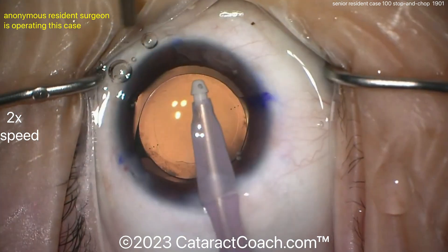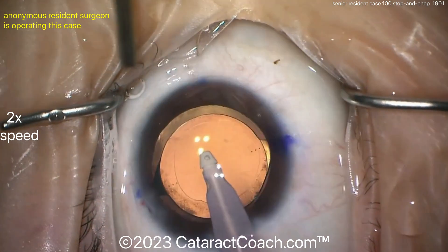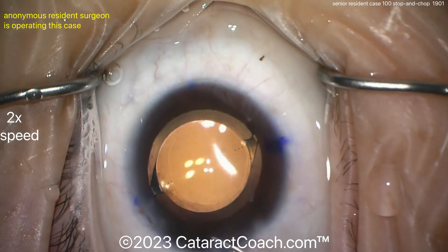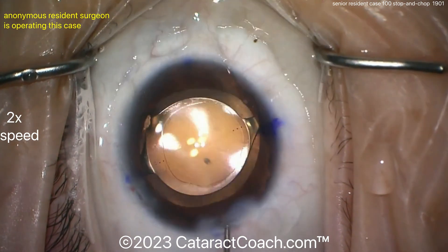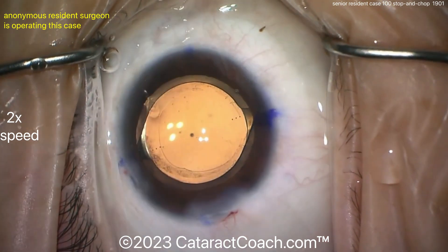Please go behind the optic and remove viscoelastic. If you don't, I can forgive it for case 100, but put that on your to-do list — that's what you need to do to improve your game. You can't leave viscoelastic there. You've got to move that viscoelastic. Good learning case — I'm impressed. Keep up the good work. Be your own toughest critic. Make a better incision next time, and yes, if you put a toric lens in, you must go behind the optic to remove the viscoelastic.